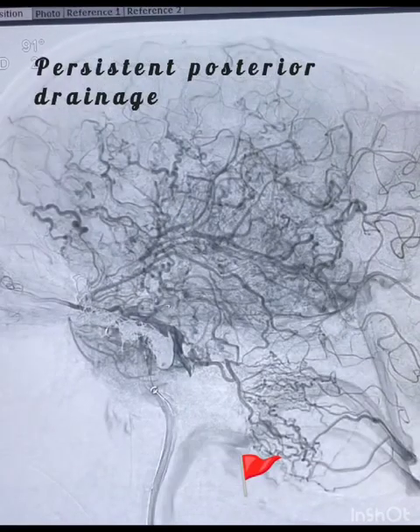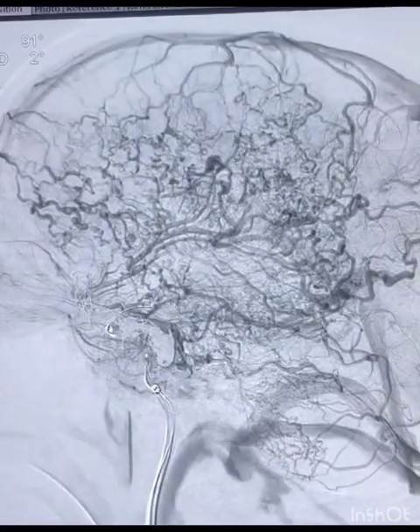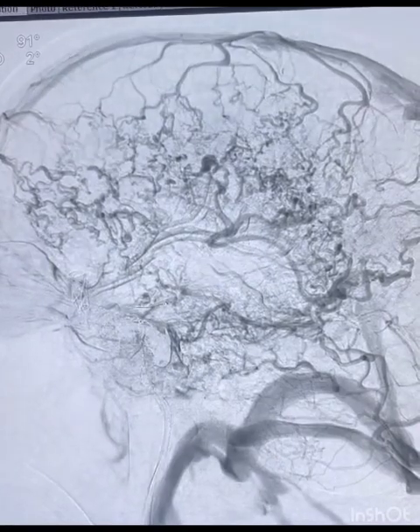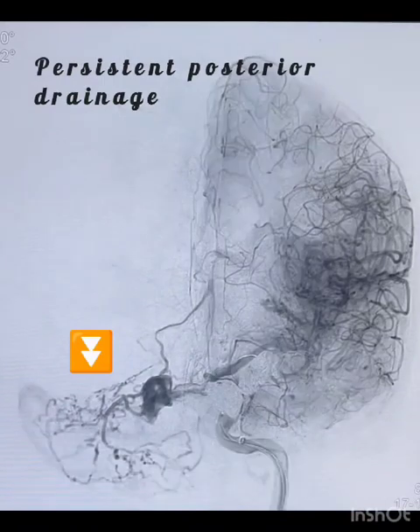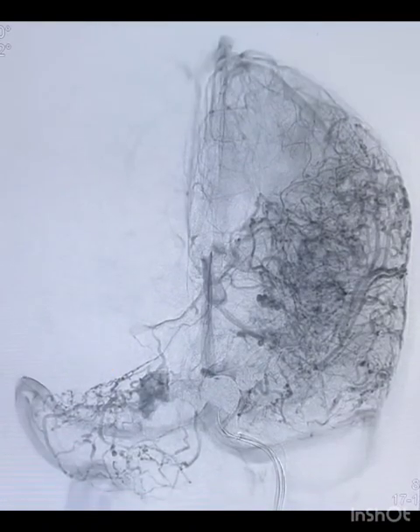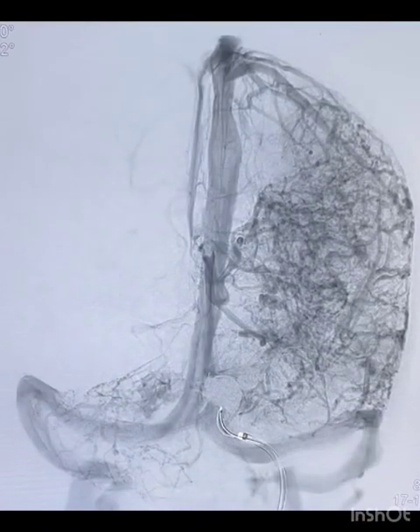Injection revealed that the anterior drainage had occluded. There was no reflux into the brain, into the superficial middle cerebral vein. However, there was an intercavernous connection that was persistent, which was eventually draining into the posterior fossa veins. Therefore, Onyx was further injected from the catheter at the rent site. Note the spread of Onyx into the intercavernous sinus.